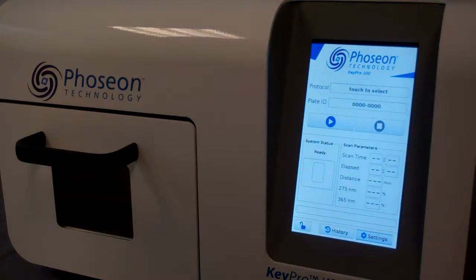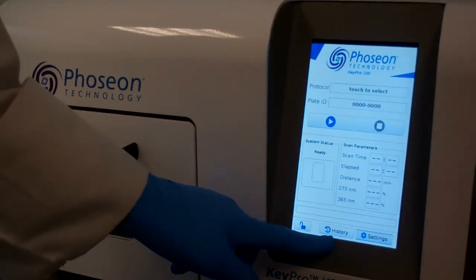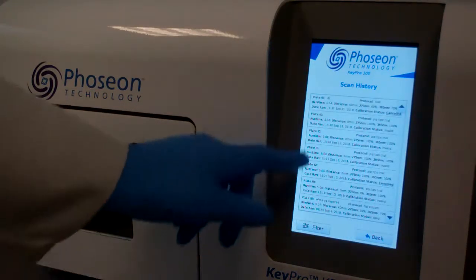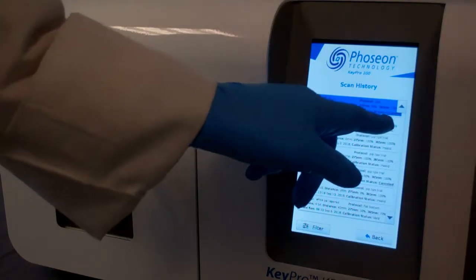To recall previous scans, select the History button at the bottom of the home screen. This page will show you all of the different parameters of the scan, including whether the lamp was calibrated or not.